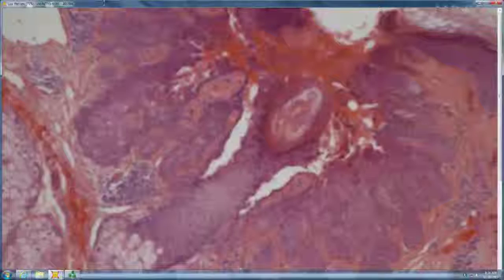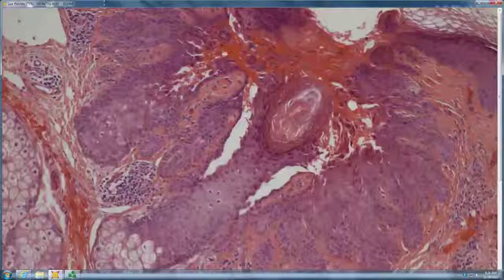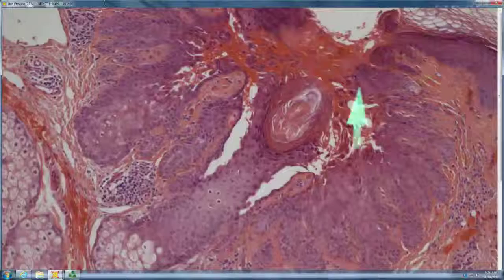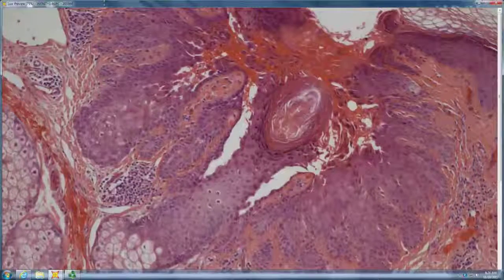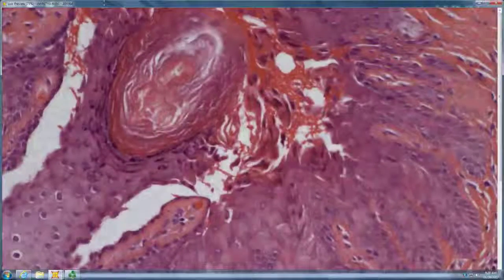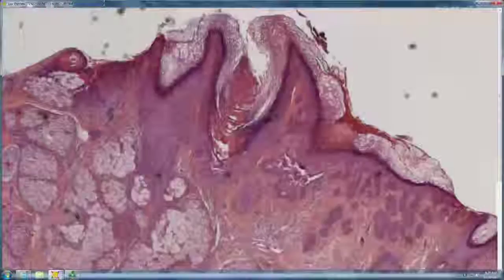There's an acanthosis. Acantholysis and dyskeratosis, clefting, formation of villi. Warty dyskeratoma. So, warty dyskeratoma if it's solitary; if there are nail changes and it's V of the chest, Darier's, Grover's, vulvocrural dyskeratosis.